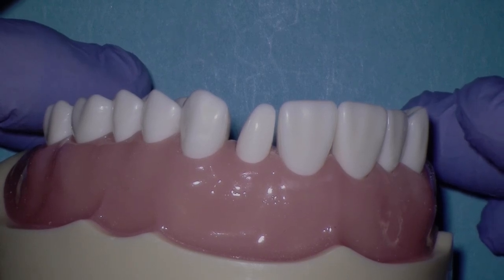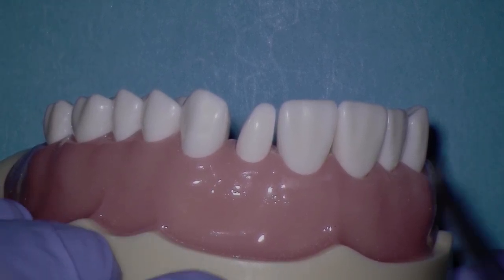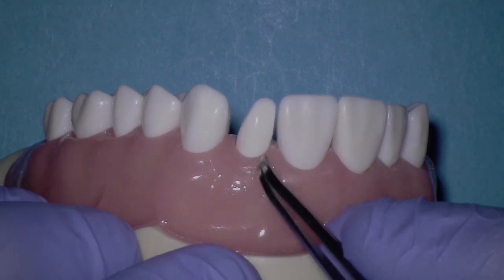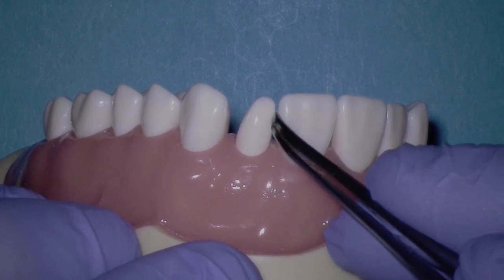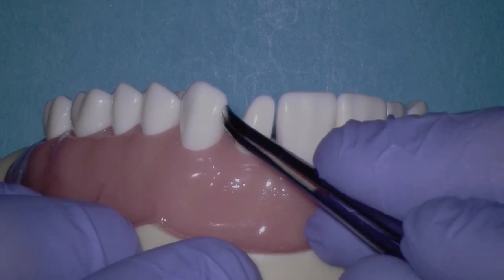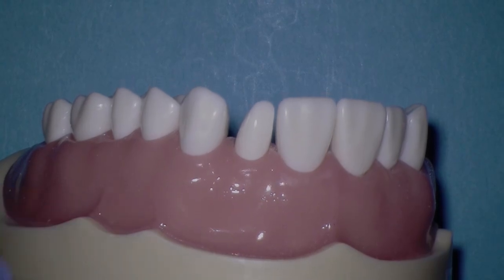Hello. We're going to be treating a peg lateral with specialized matrices by Bioclear. We're going to be using the BT matrix, which is great for both diastema closures, such as a peg lateral, and black triangles. We're going to be featuring a technique called the direct contact strut. Now, we're going to be building a contact here on the distal, here on the mesial, using two different varieties of the direct contact strut.